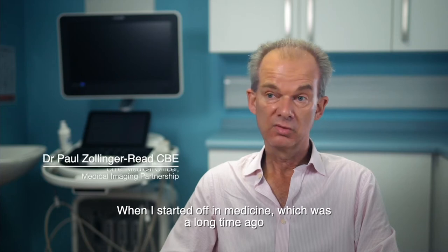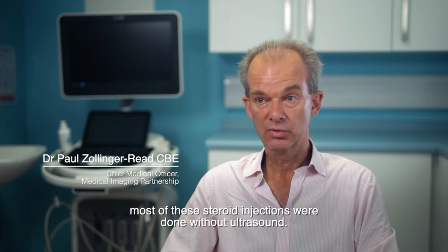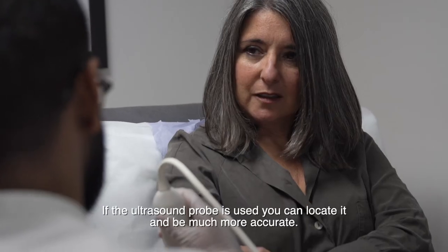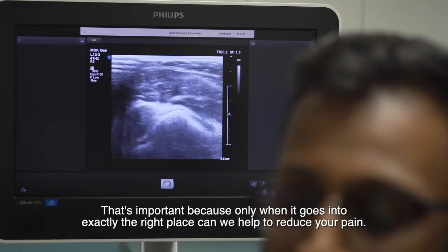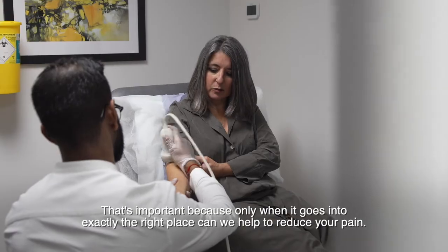When I started off in medicine, which was a long time ago, most of these steroid injections were done without ultrasound — and that would work, but it wouldn't always work. If the ultrasound probe is used, you can locate it and be much more accurate. That's important because only when it goes into exactly the right place can we help to reduce your pain.